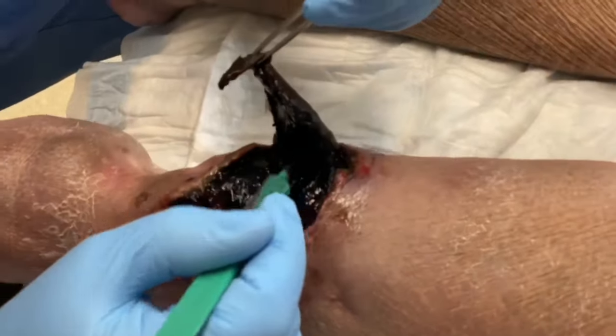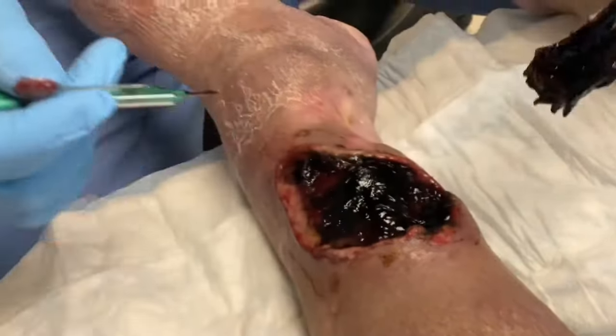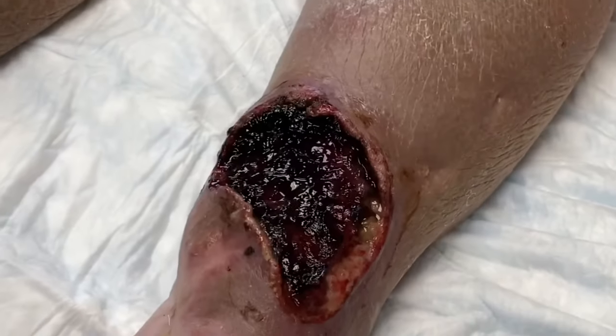So you can see what we're doing here. The treatment involves removing the dead necrotic tissue overlying the hematoma, and then you'll see what we do is evacuate or drain the coagulated blood or hematoma that forms.